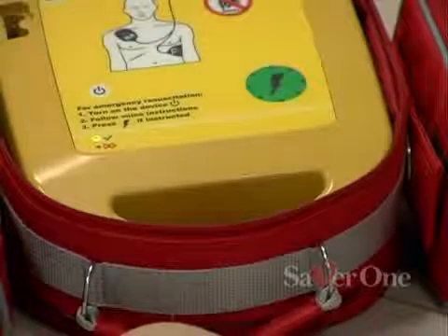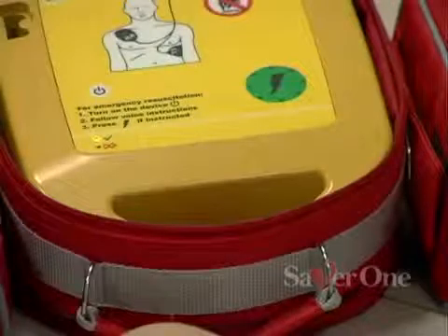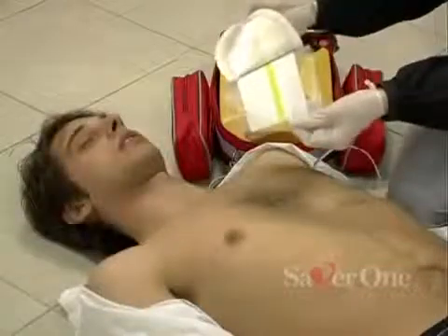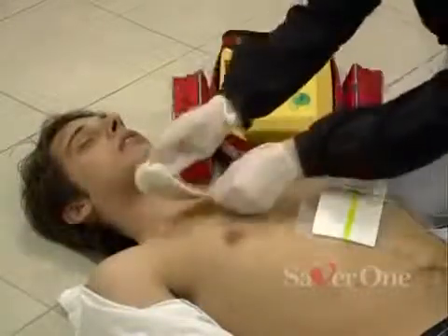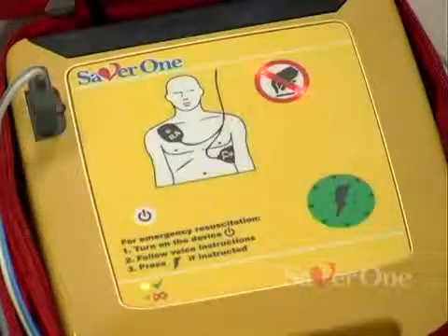Switch the device on — it will confirm it's switched on. Follow voice instructions. Place electrode pads: place electrodes on the chest as shown on the pictures on the pads. Plug the connectors — the defibrillator will now start work, informing the operator by voice messages.